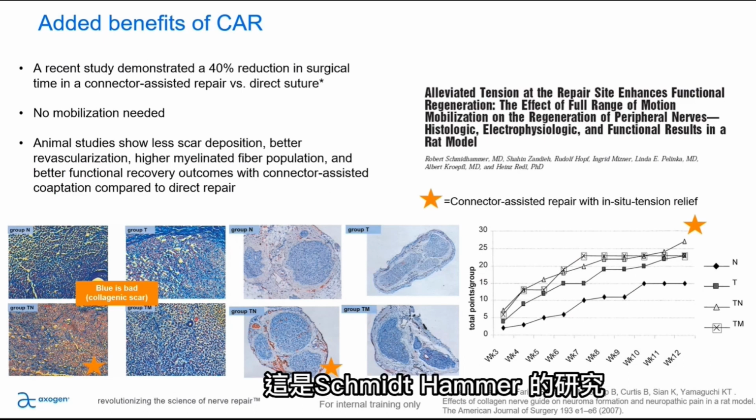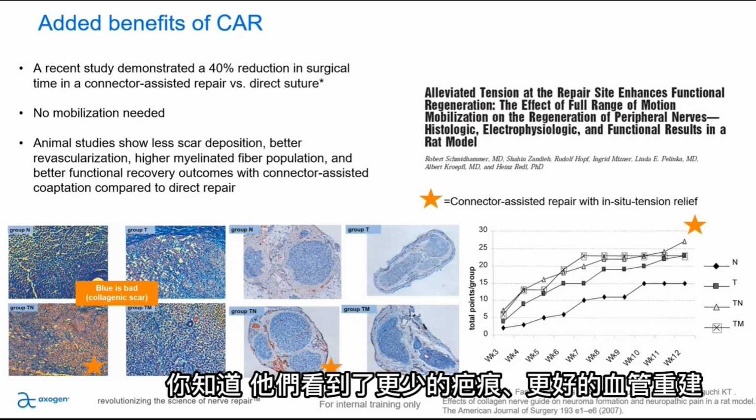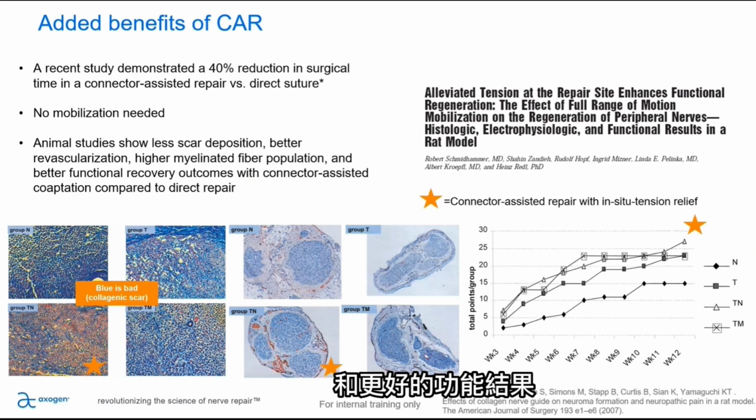And then again, I'm sure you are all familiar with this study by now. This is the Schmidhammer study. And again, it just provides some good evidence on the benefits of relieving tension with connectors. They saw less scarring, better revascularization, and better functional outcomes.